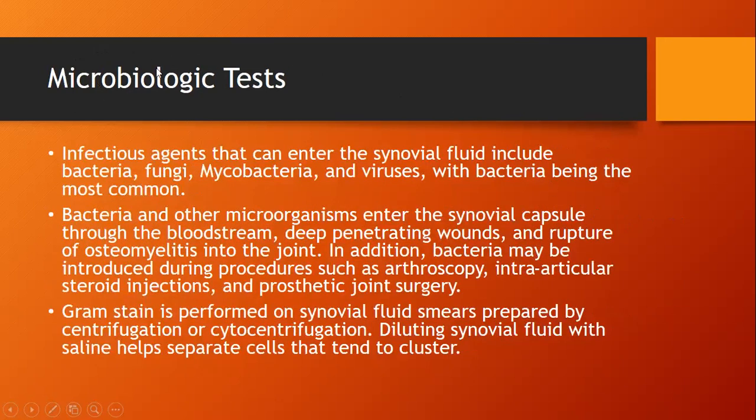Now, the last test that we could do is actually microbiologic study, wherein the synovial fluid is subjected to culture and gram staining. And when you isolate some microorganism, we proceed to sensitivity testing. That is to help tailor the antibiotic treatment of the patient. So this is used to determine the causative agent, usually present in septic arthritis.